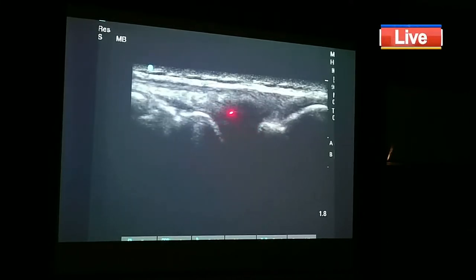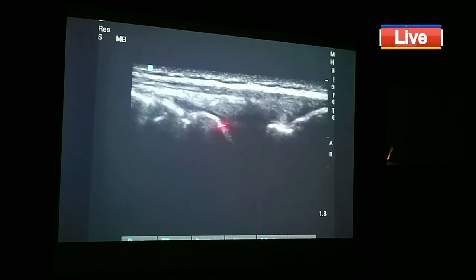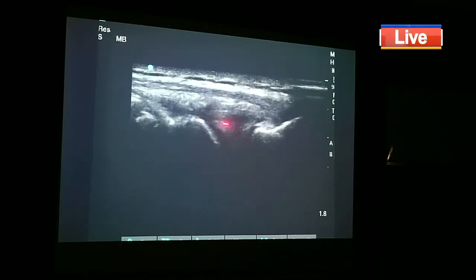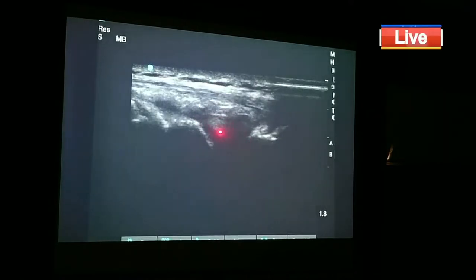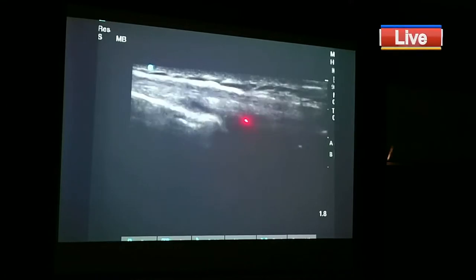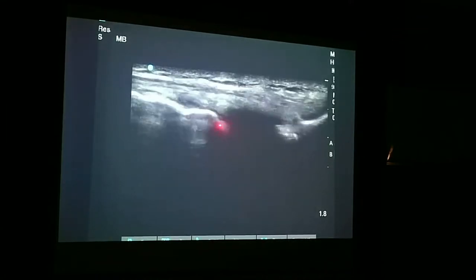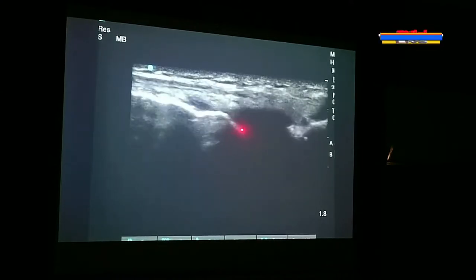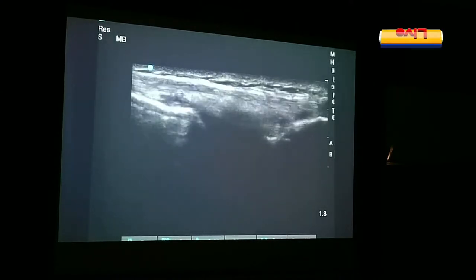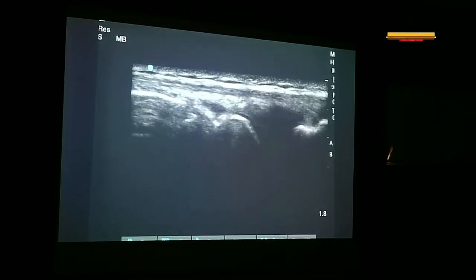This is the meniscus, young healthy meniscus. But you see why this is black? Because of anisotropy. This is a phenomenon where if I change the angle, it will become white. So I am changing my angle. Okay, white? Okay, can you see? Okay. So now again, let me show you in a better way. Ma'am, depth thoda sa aur control ho gaya.